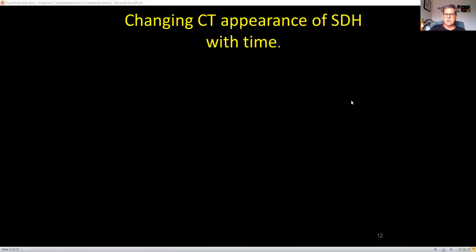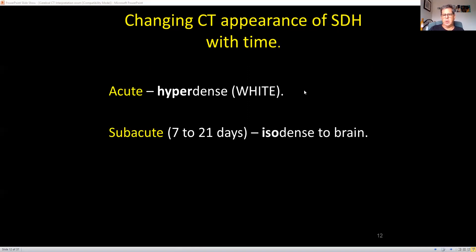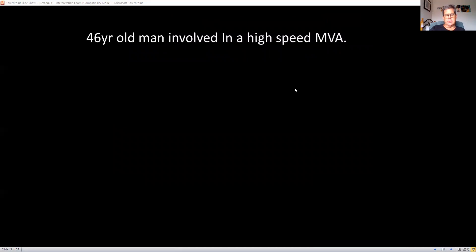As subdural hematomas change over time, the blood breaks down and becomes isodense, then hypodense. Initially, because of the high iron content in the blood, it's hyperdense. One to three weeks it heads towards isodense, and then chronically becomes hypodense, similar to CSF.